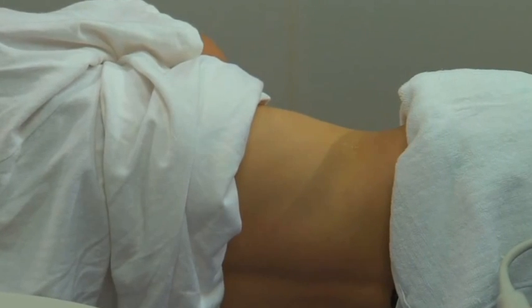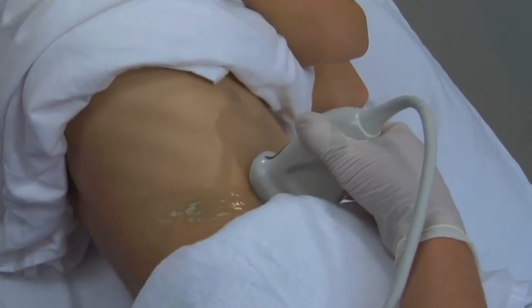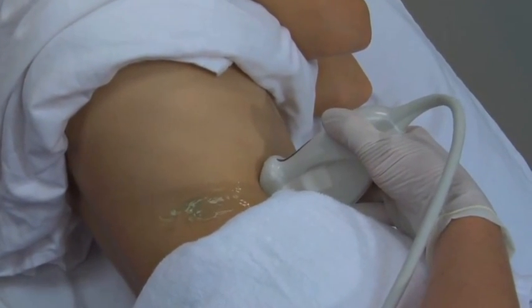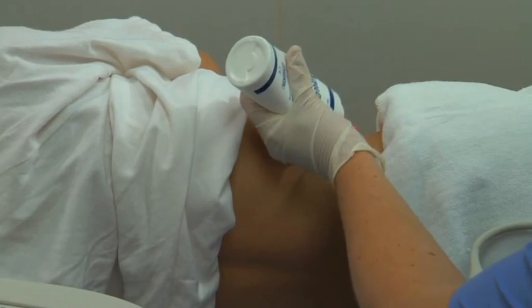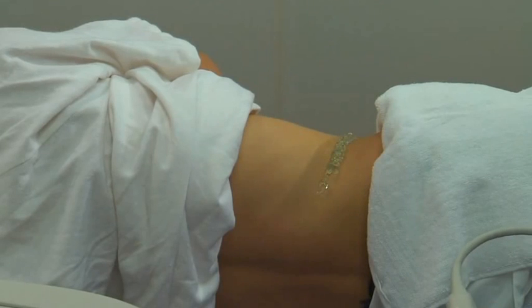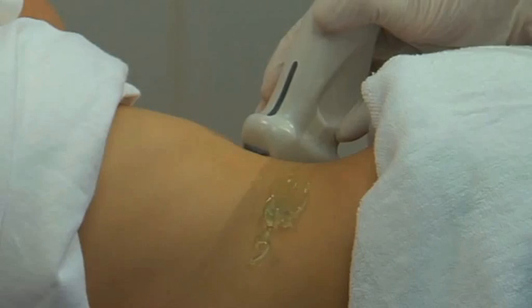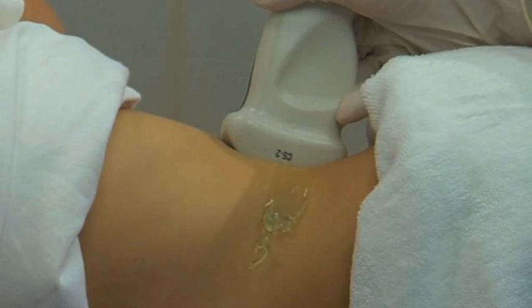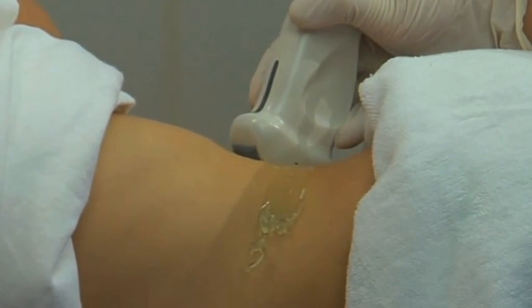Ask the patient to lie in the left lateral decubitus position. The most useful transducer positions for kidney imaging are the subcostal and intercostal approaches. Apply warmed acoustic gel to the flank along the right subcostal margin and place the transducer in the same area. Rotate the transducer into an oblique plane so that it lies just below and parallel to the ribs.